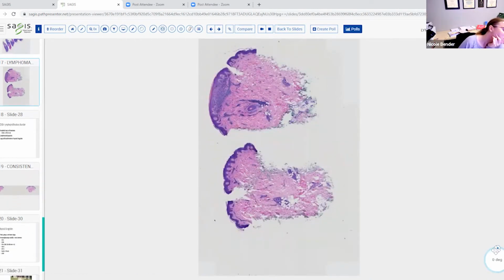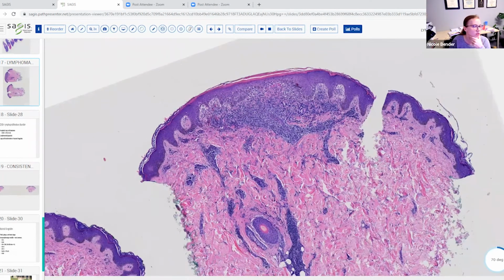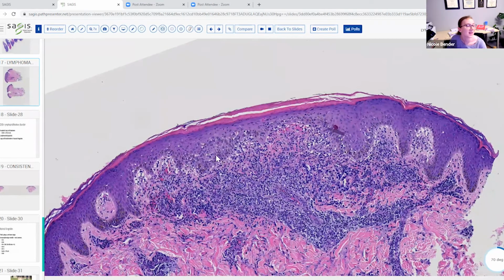So compare this to this. This case here, instead, we have a much smaller, daintier infiltrate of lymphocytes. This is more of a wedge-shaped infiltrate that we see. So we have more of a lichenoid band superficially that extends along adnexal structures into the mid to deep dermis again. When we look, we do have an interface process, so the cells are extending into the epidermis, and there are scattered dyskeratotic keratinocytes and even overlying parakeratosis with vacuolar alteration along the DEJ and obscuration of the DEJ as well.